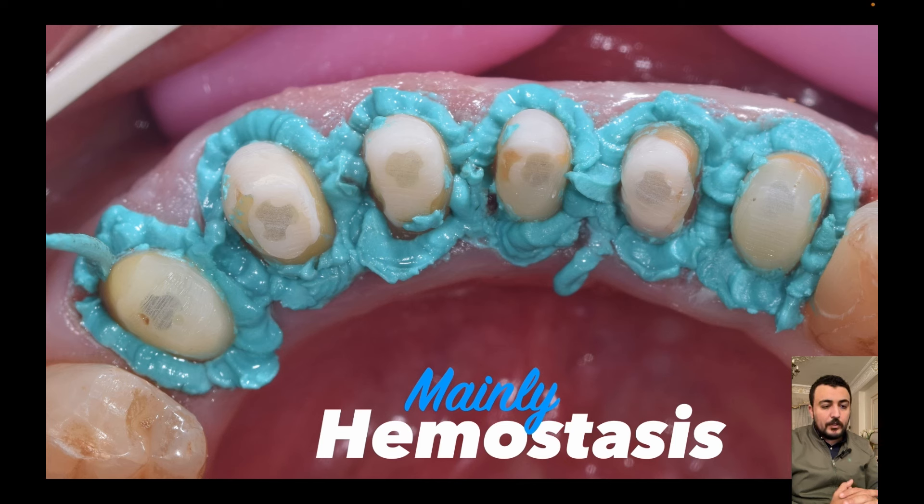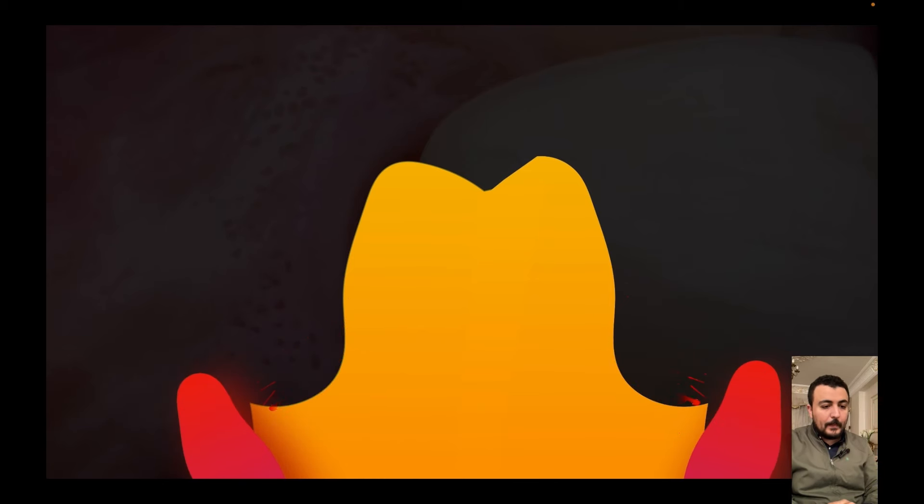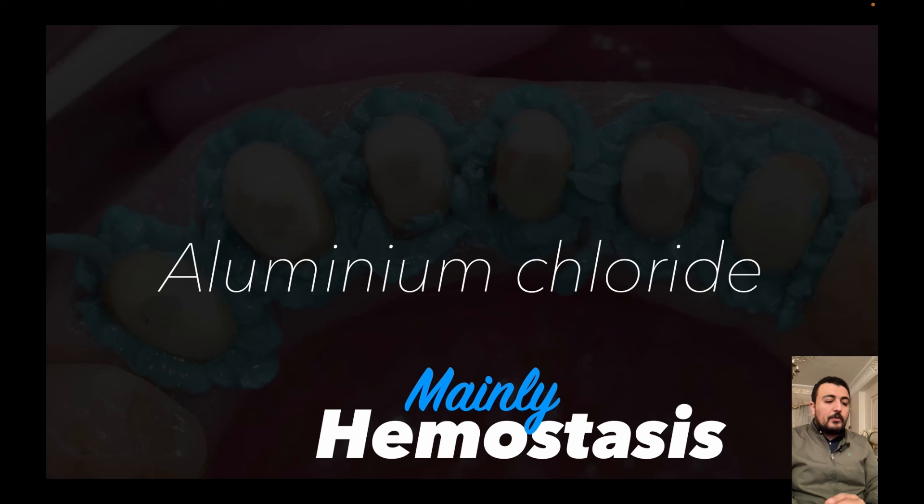So we are placing a single cord, then placing this retraction paste on top of the cord to achieve ideal retraction and ideal hemostasis. This retraction paste is mainly used for hemostasis due to the effect of aluminium chloride. Also, this material can cause little pressure, so it will not cause any trauma to the soft tissue, especially the very thin biotype gingival tissues.